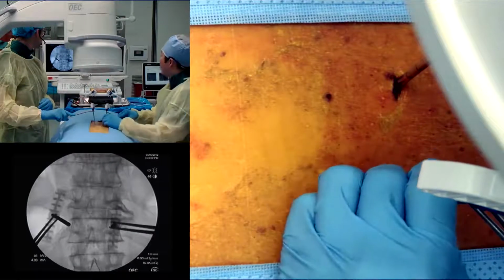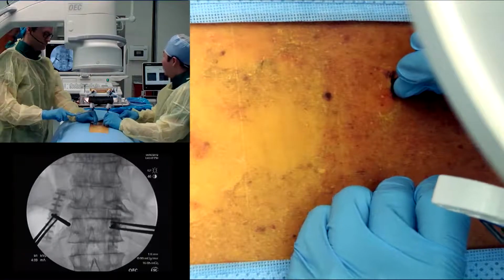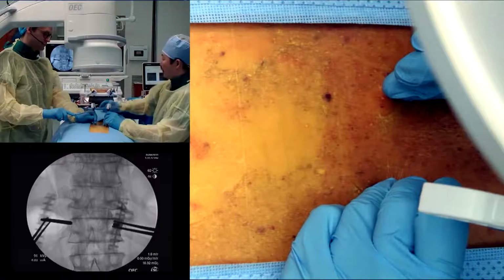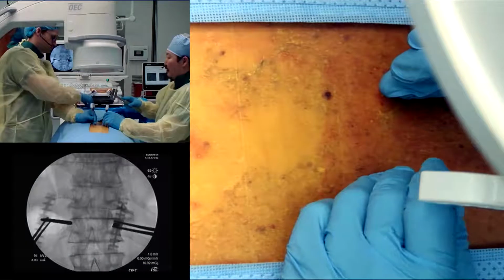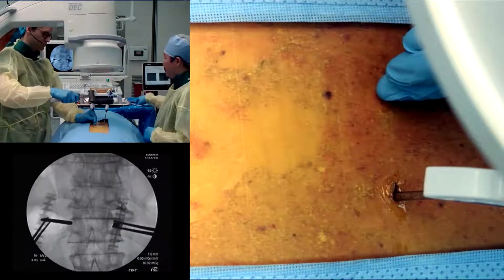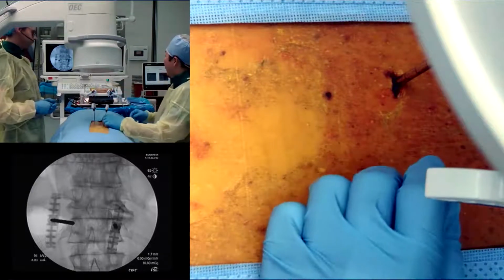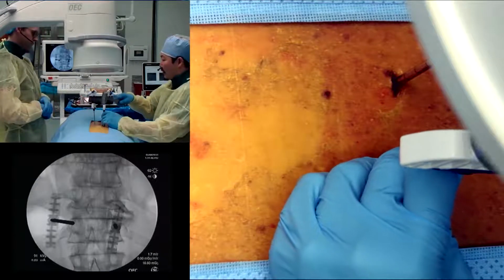Okay. And then can you pull yours back just a little bit to see where your starting point might be? Picture that. Okay. So at least I like the starting point. So I'm going to start this just a little bit so I'm anchored to the bone itself. And maybe you'll do the same. Let's see where we're at. Picture that. Okay. That looks pretty good. I would probably start going a little bit more medial. And then I'm going to go a little bit more caudal and a little less medial.